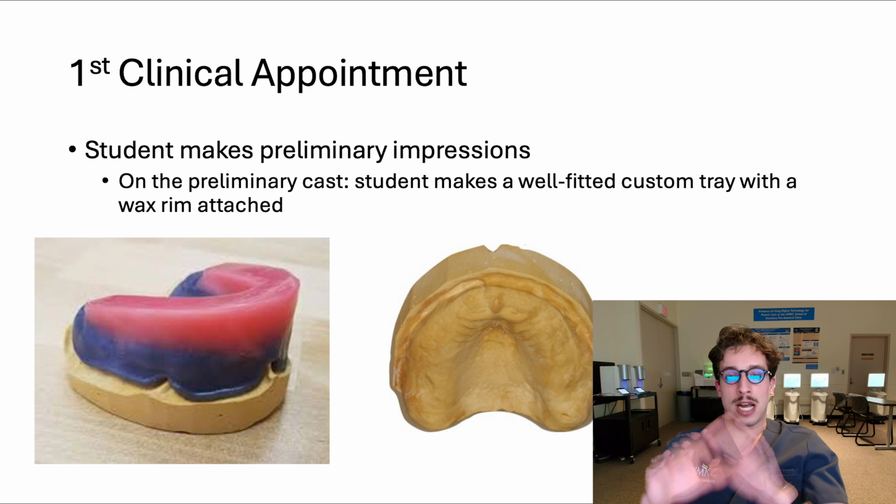The purpose of this is, like I said, well, let's back up a little bit. With a digital denture, we don't have a need for a master cast. We don't have a need for a record base because we're not actually going to be setting teeth on this record base. We're going to be doing it digitally. And so actually we will be losing accuracy if we go through the process of fabricating a master cast and then doing a record base and scanning that in.